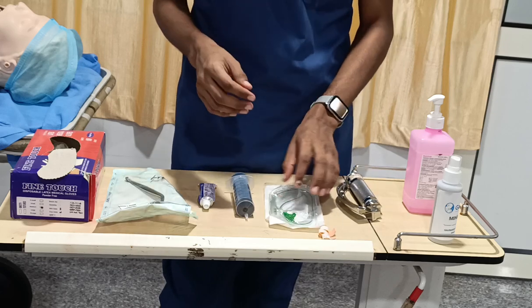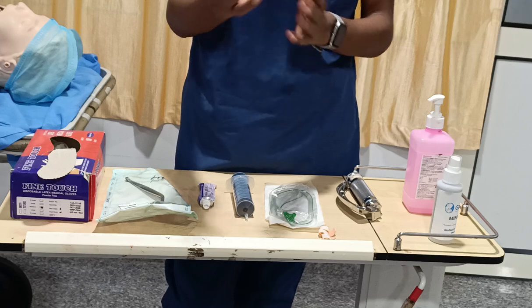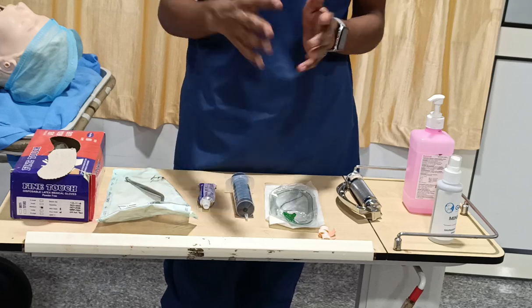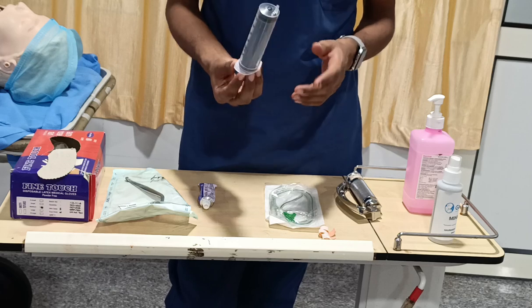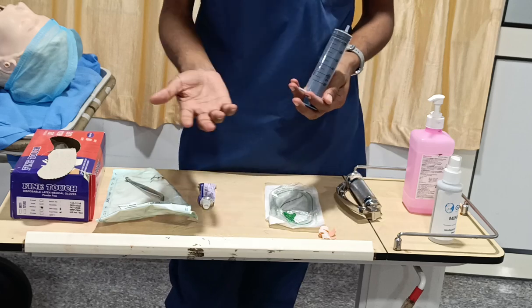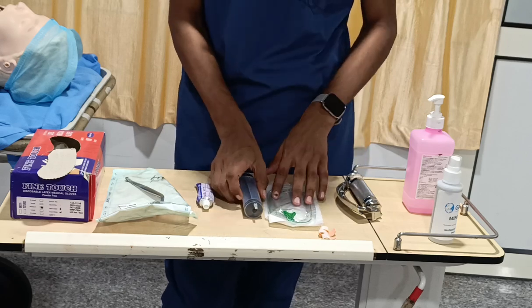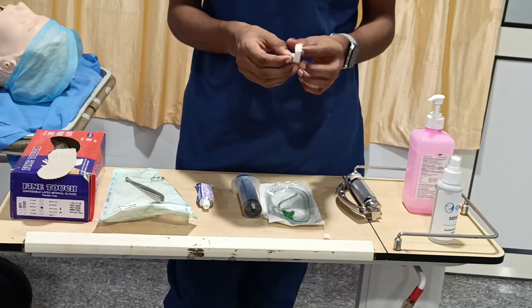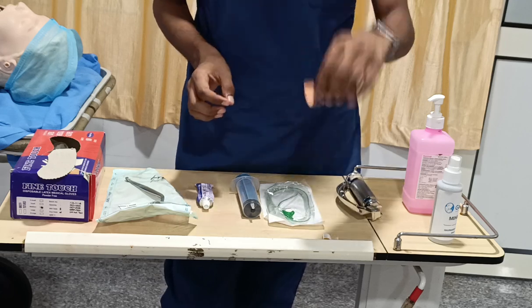If you are getting into pediatric cases, based on the age and size, the circumference of the baby, that size will be different. And then to verify or to feed, we have a 50 cc syringe. Ideally some people will go with the 20 cc also, but ideally you have to choose the 50 cc syringe. And then here I have an RT fixer. The Ryle tube fixer made by Dynaplast, that you also have to take.